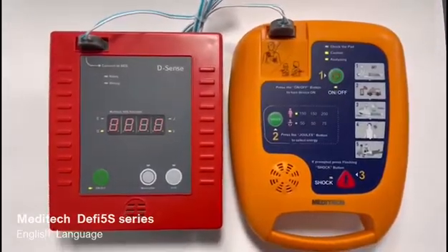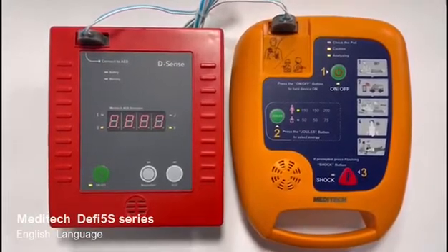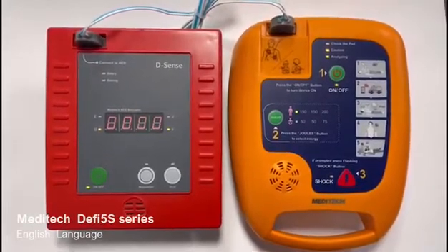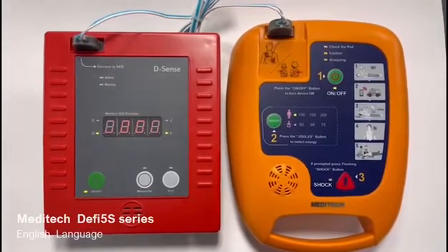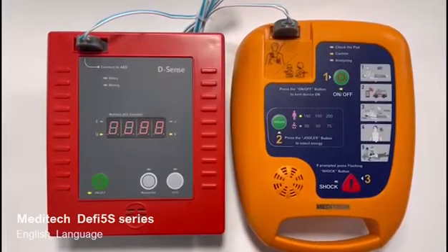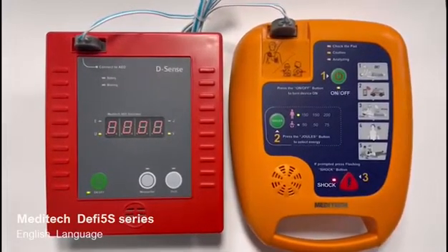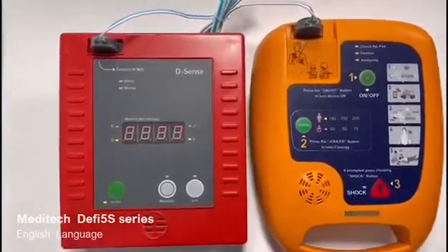Do not touch patient. Analyzing heart rhythm, please wait. Shock advised. Press shock button. One shock delivered. Start CPR.